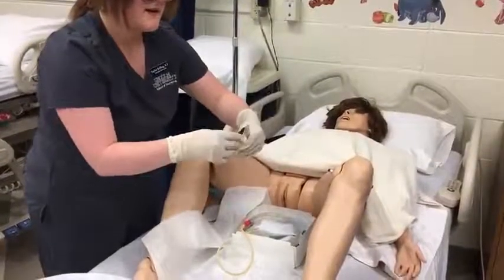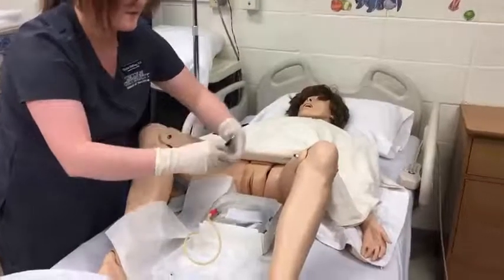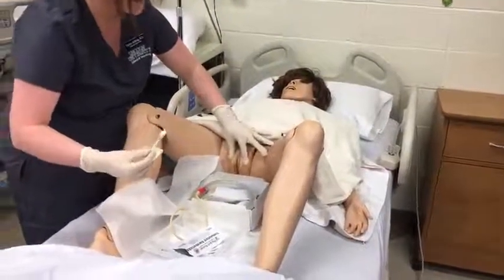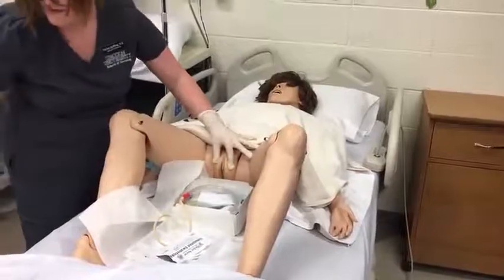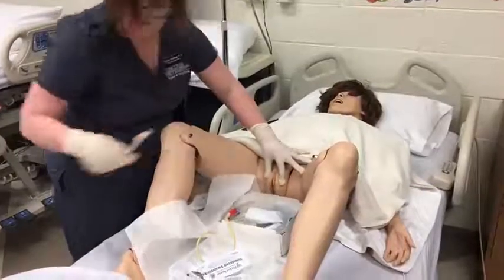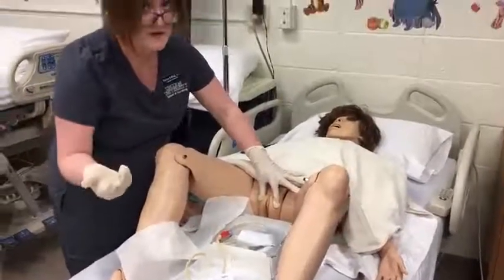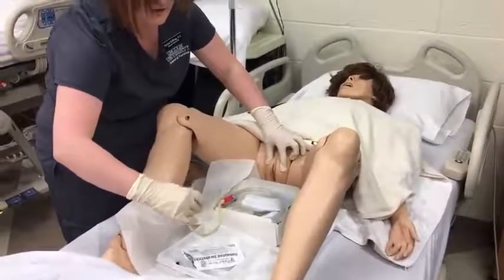I'm going to take these sterile swab sticks in order to perform perineal hygiene. I'm going to use one hand and break my sterile field. I'm going to spread the labia, clean the area farthest away from me first, discard, then the area closest to me, discard, and then one straight down the middle. You want to make sure that you don't close the labia after this, because then you would have to start the process over again. Now I'm going to make sure this is well lubricated.